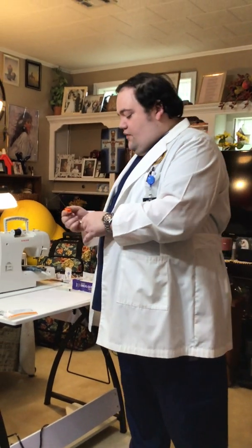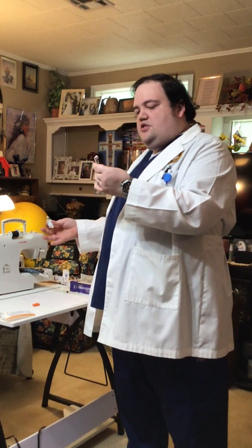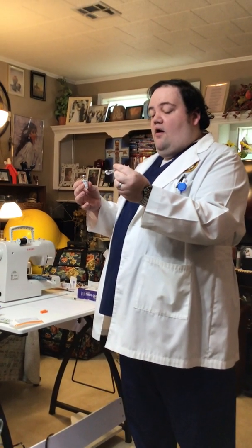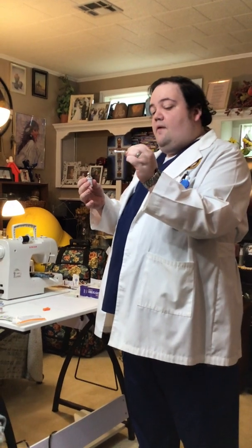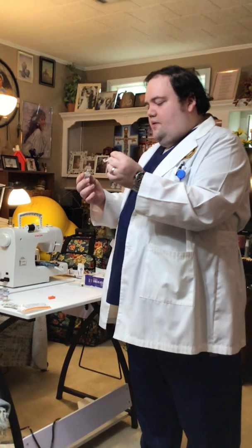Brand new vial. Now again, we verified that this is NPH insulin. It's not regular insulin. He was ordered NPH. So brand new vial. We're going to flip our cap off. He's been ordered 25 units. See, I'm constantly checking. We do not aspirate any air or inject any air into insulin because it froths up, and NPH is thick anyway.